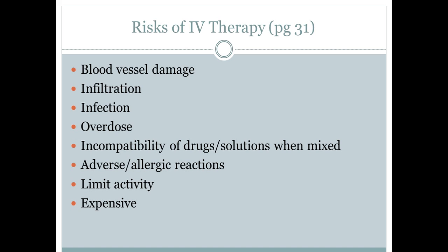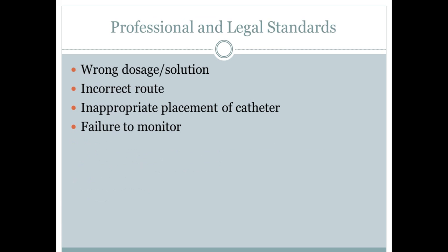Some other risks would be adverse or allergic reactions. It does limit the activity of the patient. More specifically, depending on where that IV access is going to determine what activity is limited. It is expensive. All the tubing and everything obviously is more expensive than most medications where it's in a pill.